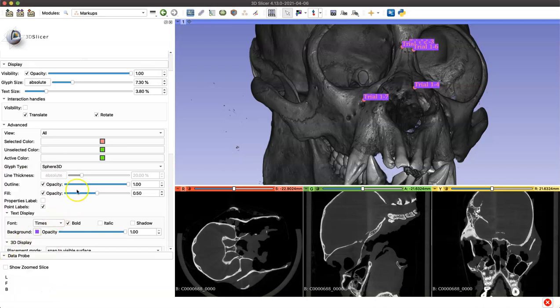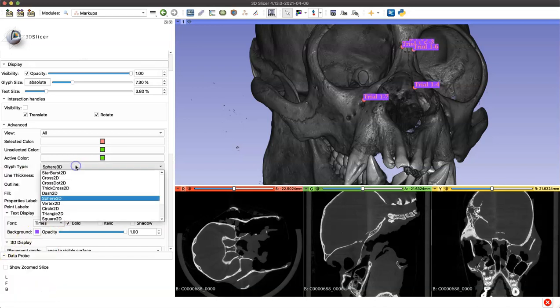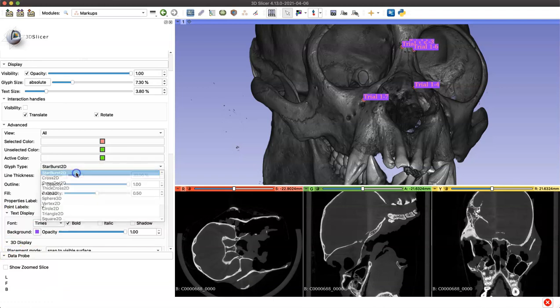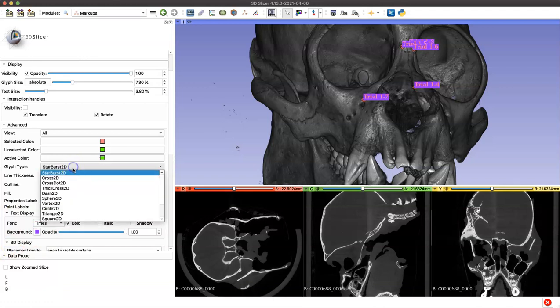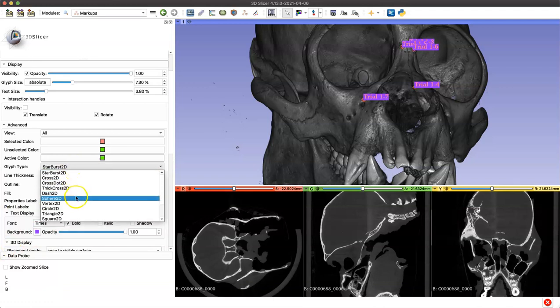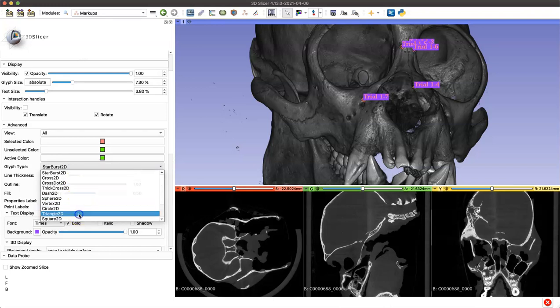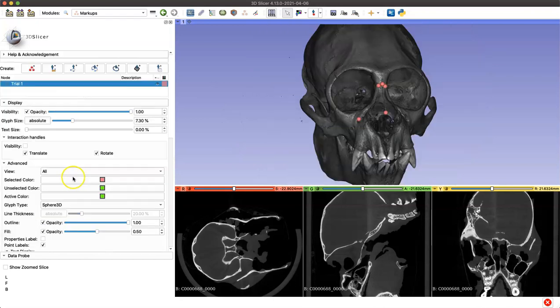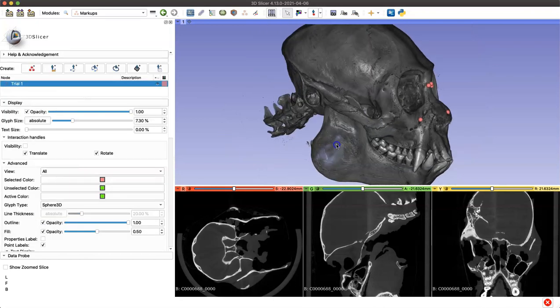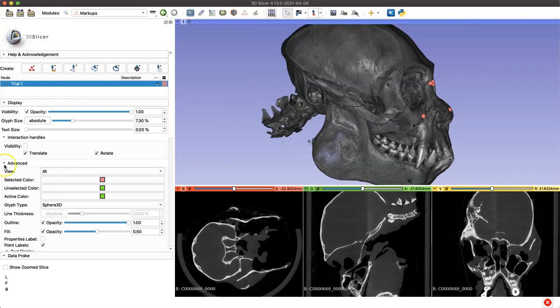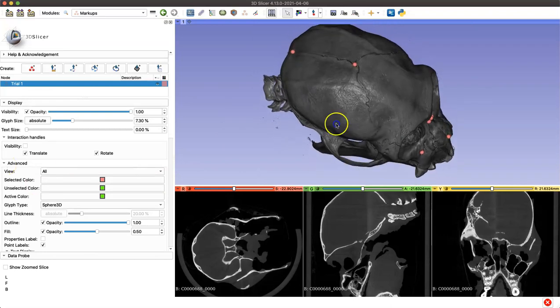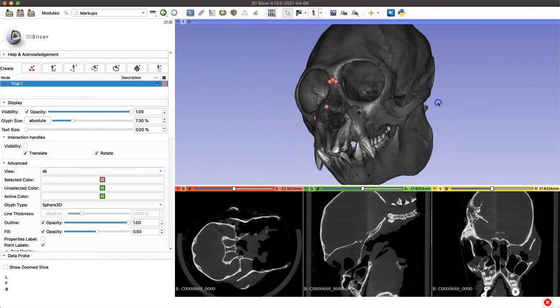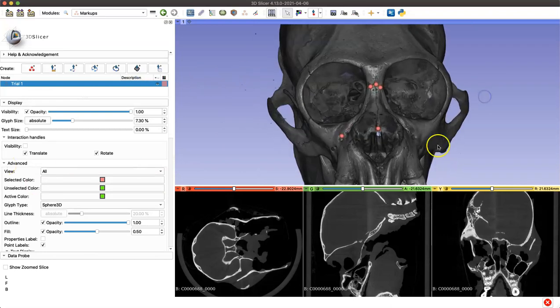You can also change the shape of your glyph, your landmark itself. Right now we have it set to 3D spheres, but you can customize it however you'd like. I'm going to reverse the changes we've made so far and just move our model into position here.